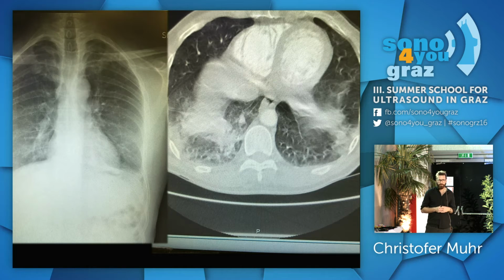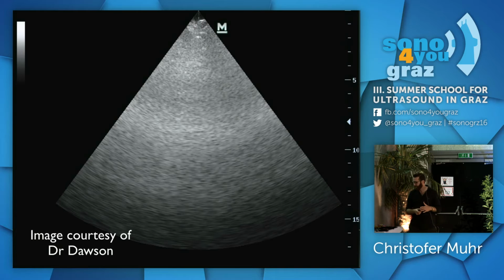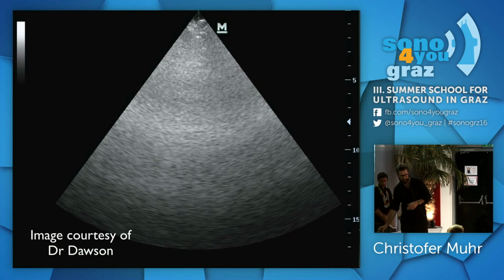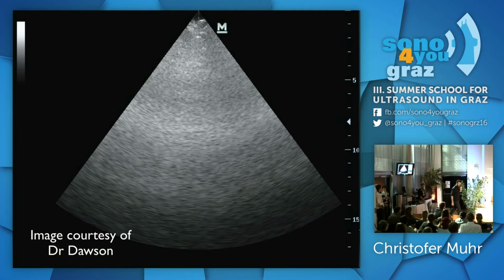Okay, are you convinced that it's kind of useful? You already were. But once again, this is how it's going to look from the beginning, and it especially did for me. It's really annoying, but keep on working, all right? So now I'm just going to give a couple of tips on how to get those cardiac windows, all right? Where's my body?